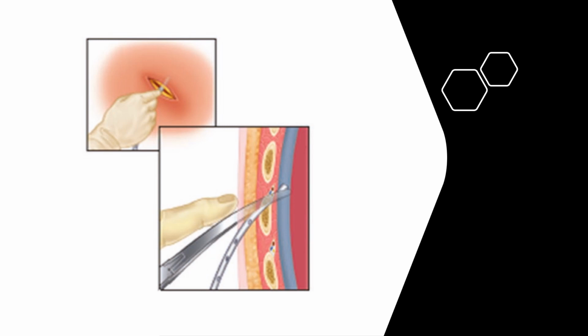11. Grasp the proximal end of the tube with the large Kelly clamp and pass the tube through the thoracic cavity along the previously dissected tract. 12. Release the clamp and continue to advance the tube posteriorly and superiorly. Make sure all the fenestrated holes of the tube are within the thoracic cavity to prevent unnecessary manipulation or replacement of the tube.